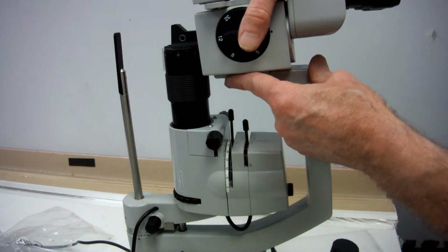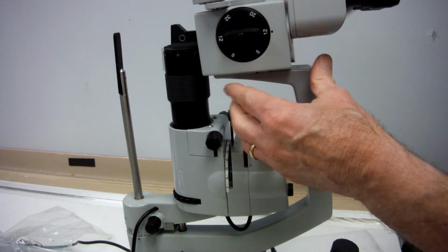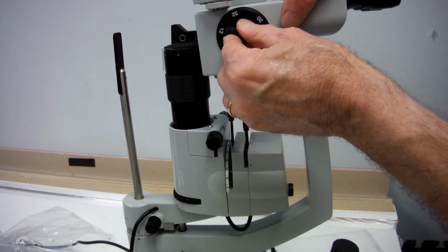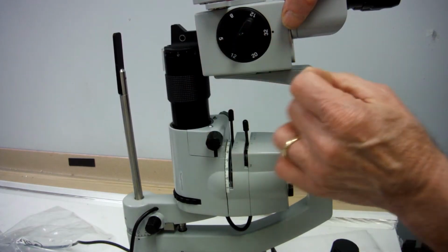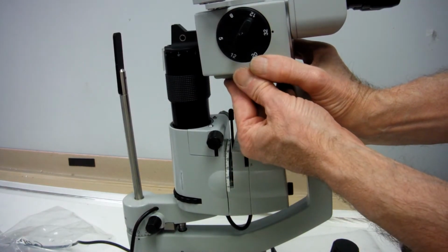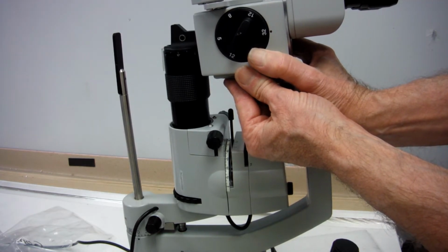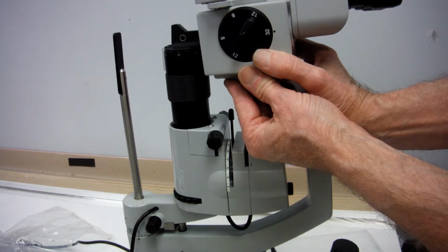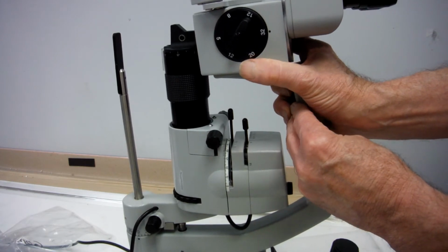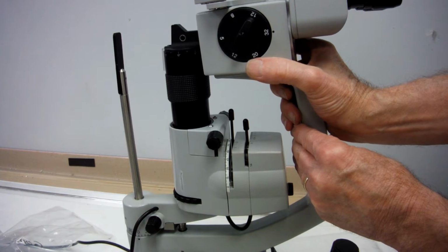Now anytime you move your head left or right, it's possible that you're going to get out of focus. And so to make sure that you're in the right focus, one way to do it is to put your mag changer on the highest number. Here's 32. And then pull your head in and out, forward and back, to get the sharpest image. You'll also have to be careful when you're moving it back and forth that you're turning it. So it may take a while to get it not only centered but also in focus.